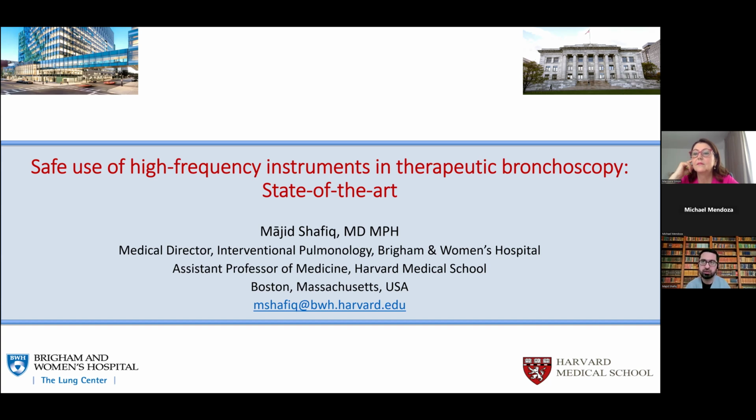The one caveat, though, is that if you have very severe obstruction in the trachea, and most of the lumen's already gone, and then you use cryotherapy alone, there's a real danger of the patient coming right back with life-threatening respiratory obstruction when the tissue starts sloughing off in 48 hours.